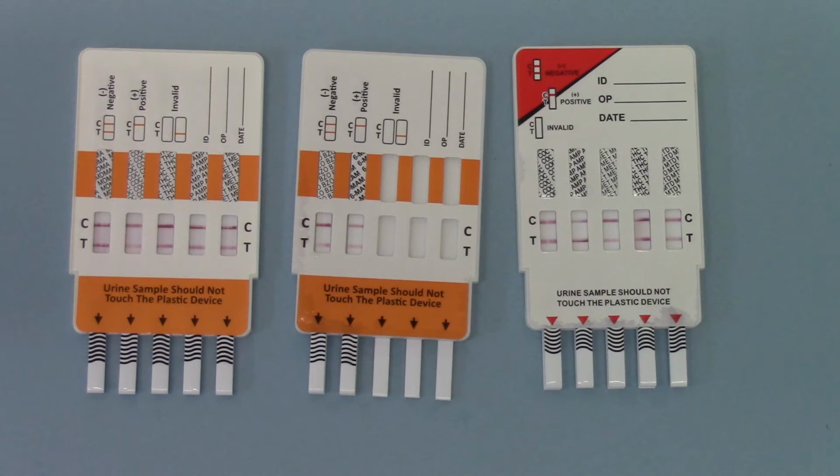It's impossible just to run a single element of any one of these tests, so when you are buying these panels, you are buying 10 results on a single sample in a single test procedure. You can't take them apart and run individual elements of each test. So I hope that shows you some of the variants on the different combination tests and the difference between them.